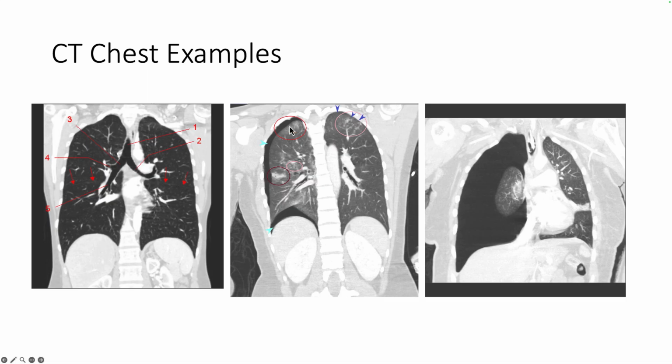Over here we see on the patient's right side, and again this is flipped, right and left, because it's like the patient's looking at you, we can see on the right side this black line that's all the way around the lung. This is a relatively small pneumothorax. This is air, the black that's in here. And you can see on the other side, maybe they're pointing some arrows at a little bit here, but I'm not seeing very much pneumothorax on the other side. So you can have it on one side, you can have it on both sides, but the two don't connect.